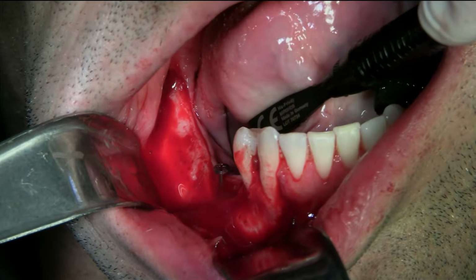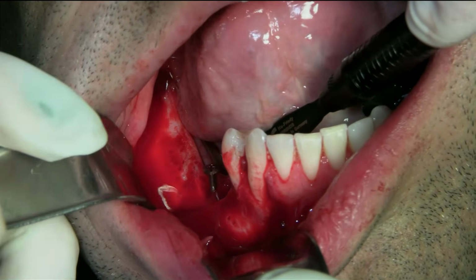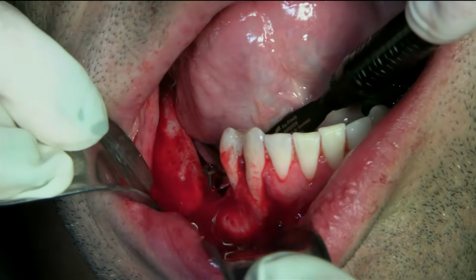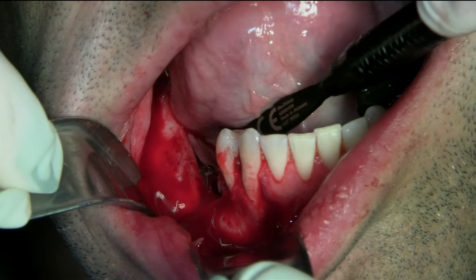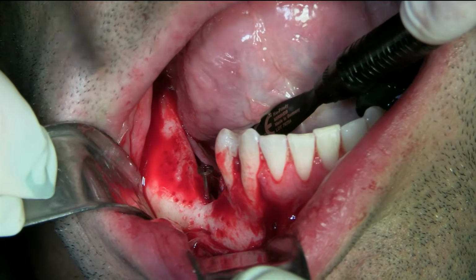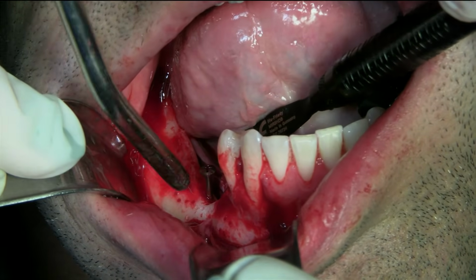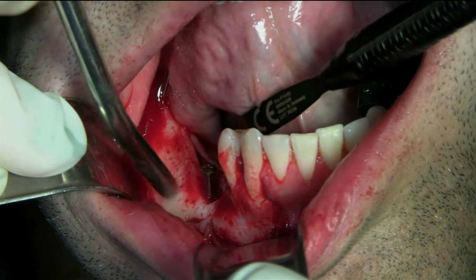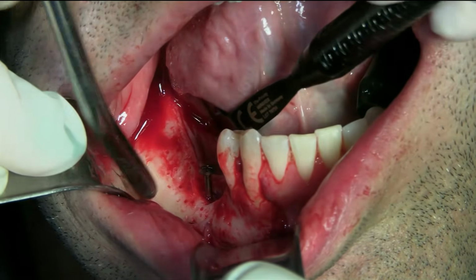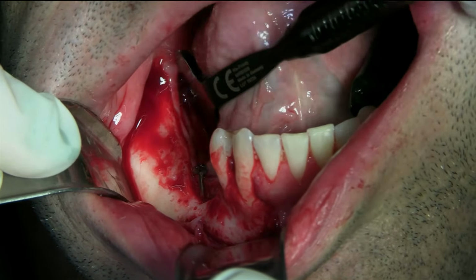Actually, if you can put this one and this one, then she can suction. But be careful with the mental foramen. Okay? Keep this one in the bone here. Yeah. Here's the mental foramen, okay? So this needs to go more back, and that needs to go more front. Okay, that's good. And let's see how the membrane will fit.